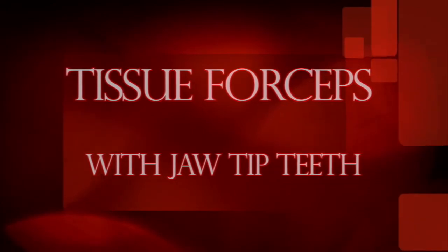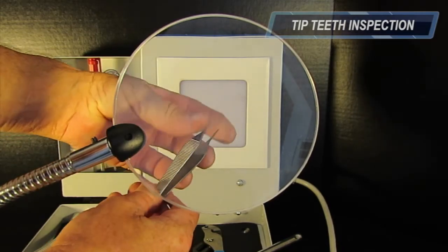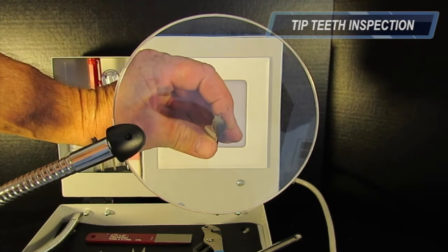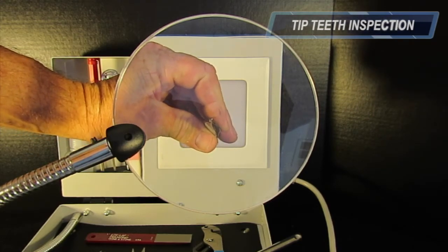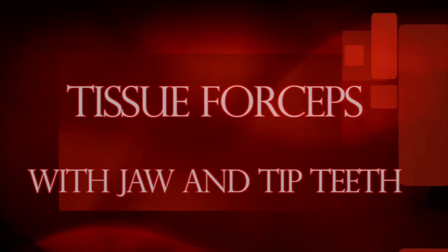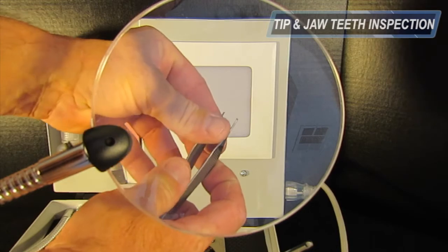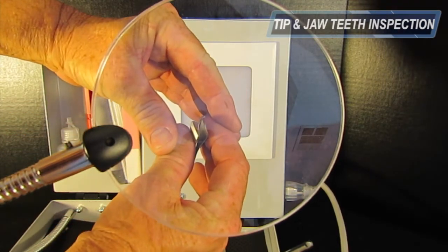Always finish tissue forceps inspection by checking the jaw separation. Tissue forceps with teeth at the tip of the jaw: to inspect these forceps, inspect the teeth for burrs and confirm they are not bent. Next, slowly close the instrument while viewing the tip head-on. The male and female teeth should intermesh without contact until completely closed. For tissue forceps with jaw and tip teeth, use a combination of the two previously mentioned inspection processes.